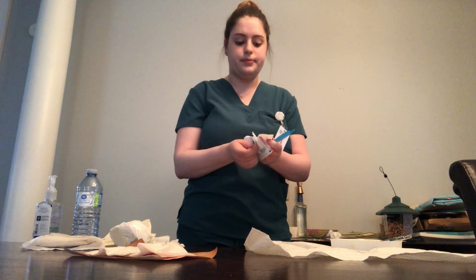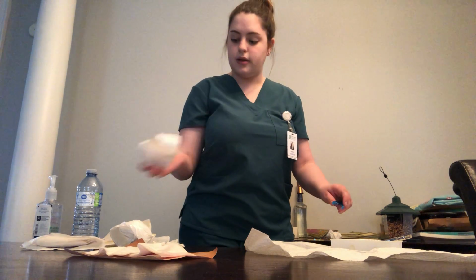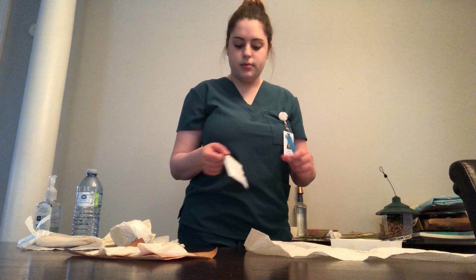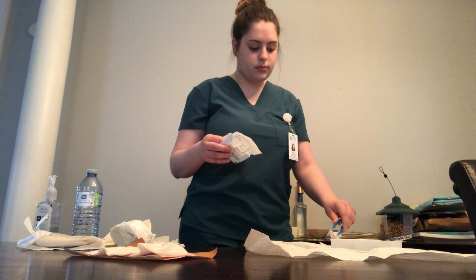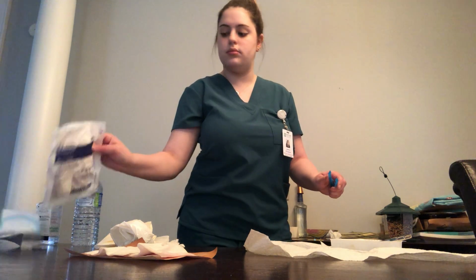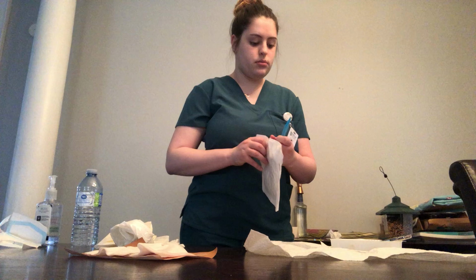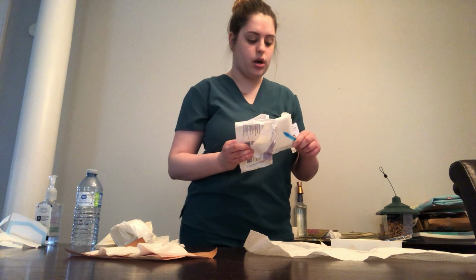I am then going to open everything. So all of your gauze and abdominal pads, those are going to come sealed. So you're going to banana peel it open and pull it out with the forceps. And this can go in the garbage. Can't reach it. You're always carefully maintaining that 1-inch border.